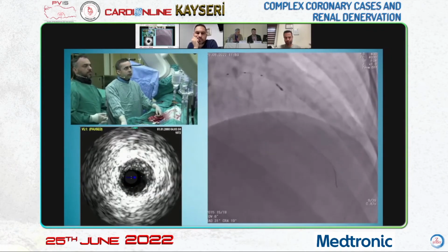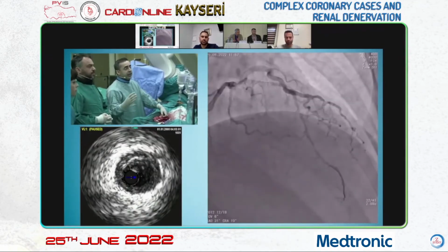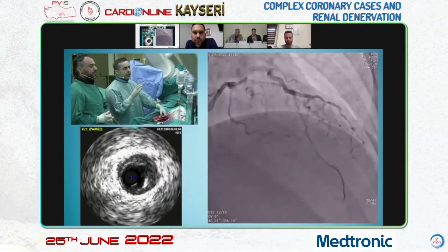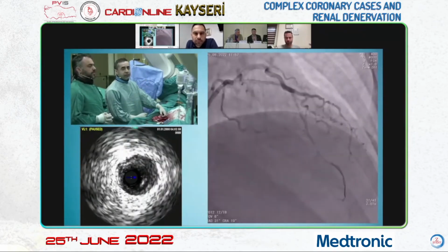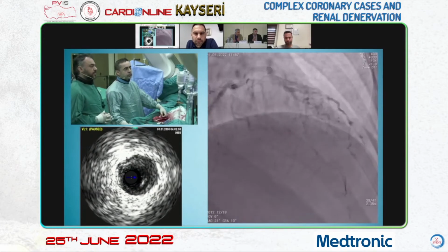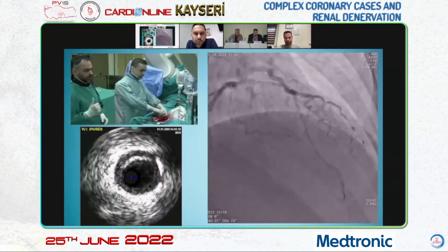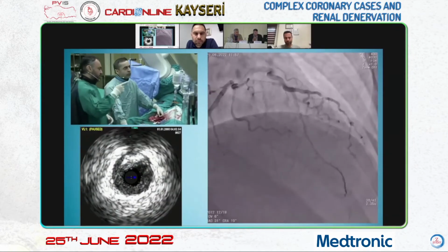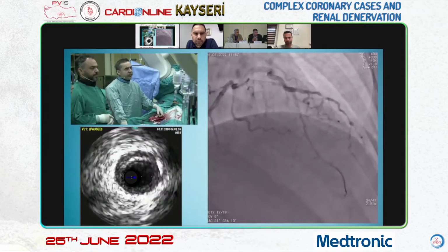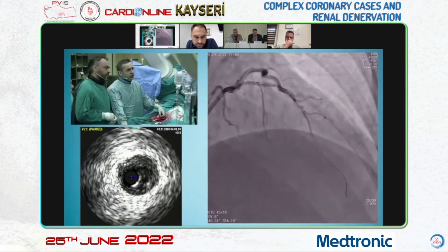The area where the septal is, there's an IVUS catheter. From this septal part, we have to put the stent here. What should we do angiographically? Are you asking about stent implantation? We can put it in the septal as far as I see, maybe from a different projection, and we can say this is what I believe. So do we have to assess the proximal segment?